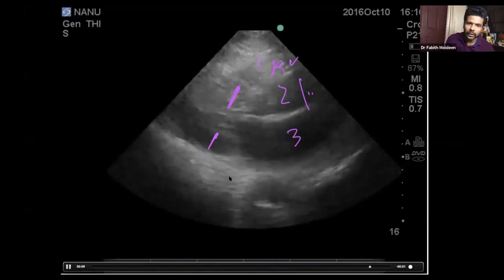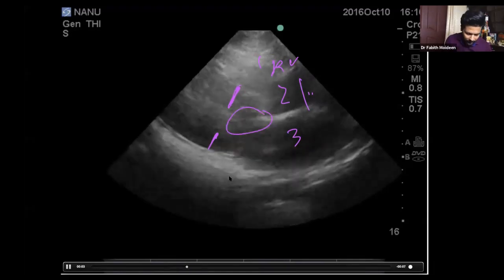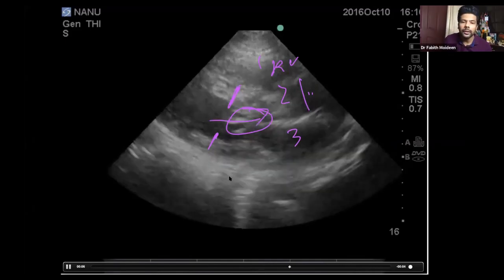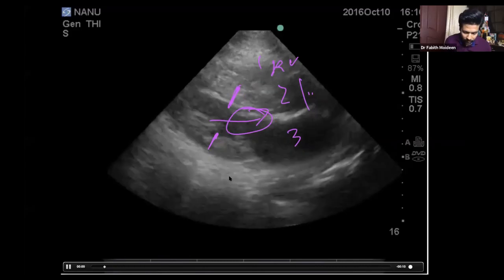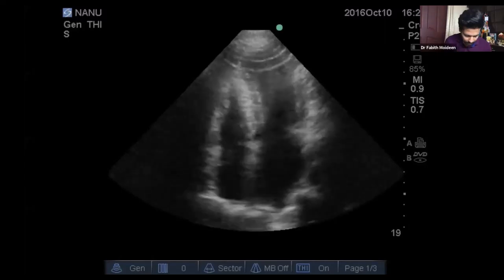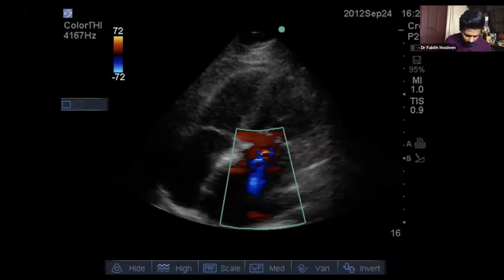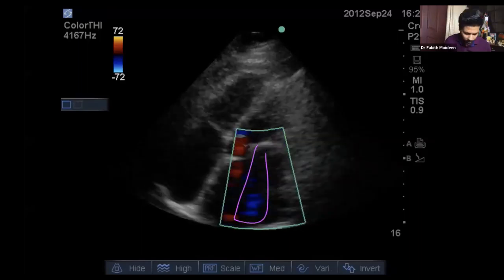This is showing septal thickness, and you can see that the mitral valve is completely obstructing the flow of blood into the aorta, so that becomes obstructive as well. That's an emergency, and you have to make sure that the patient is referred to a cardiologist. There's a problem for this patient. Same thing I already told you: there is mitral regurgitation, with the blood jet touching the posterior wall.